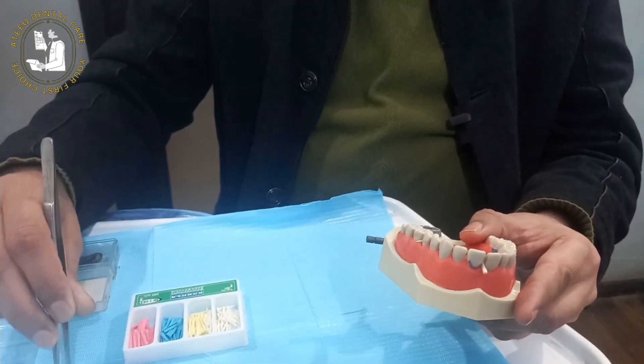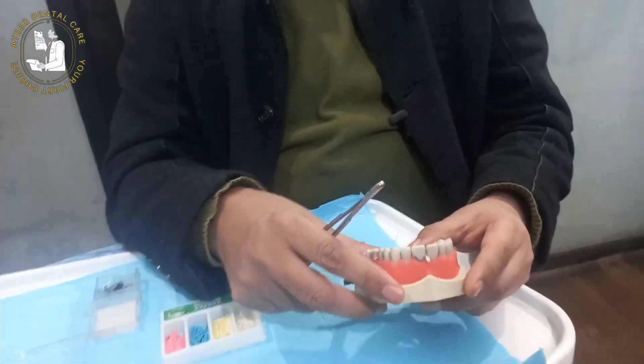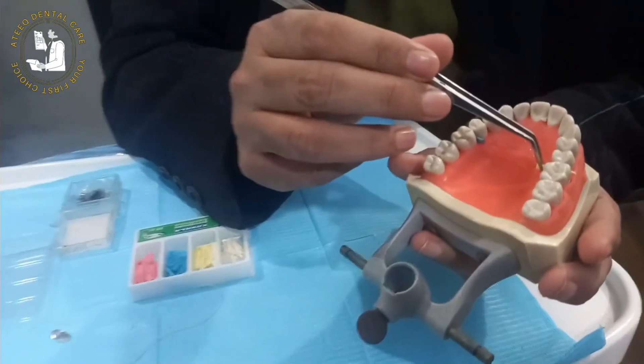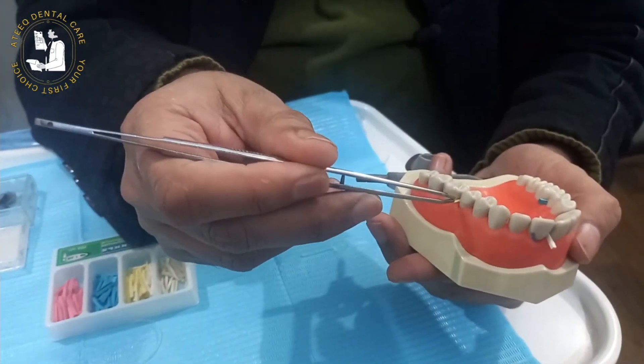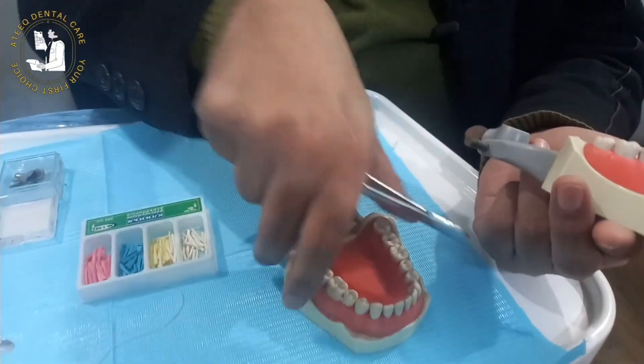This lecture is hopefully very informative. You've learned the functions of pre-wedging and where to place the wedge — especially from the wide embrasure side. In upper maxillary teeth, we place the wedge from the palatal side. If it is the lower arch, we prefer the buccal side, as the buccal side is wider than the lingual side in the lower molar.